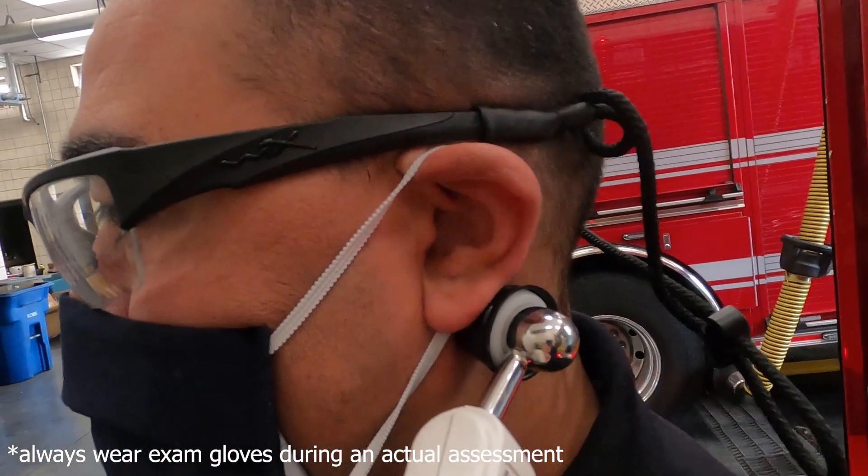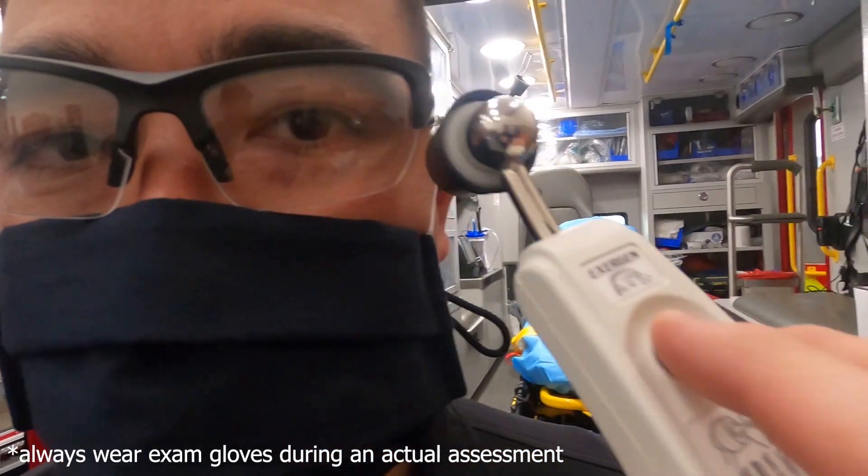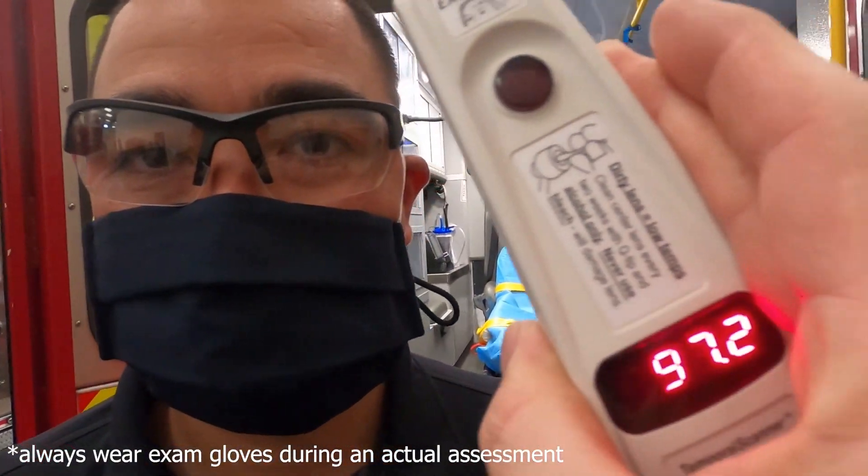Keeping the button depressed, then place the probe on the neck behind the ear. Release the button and read the temperature.